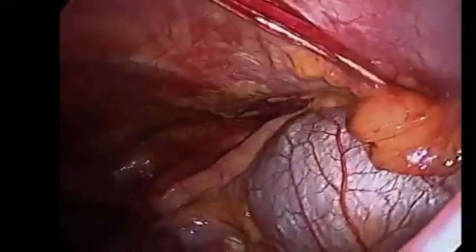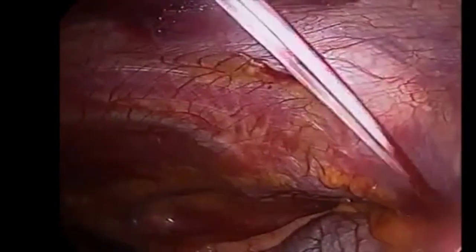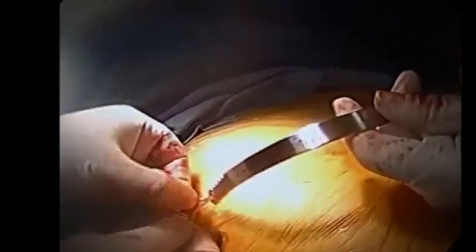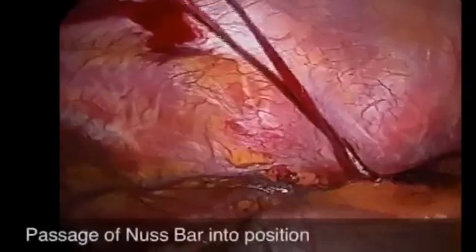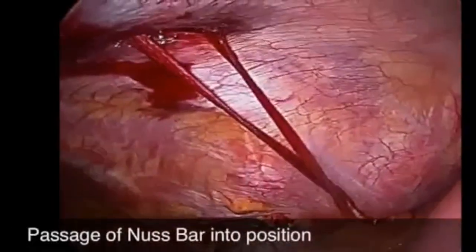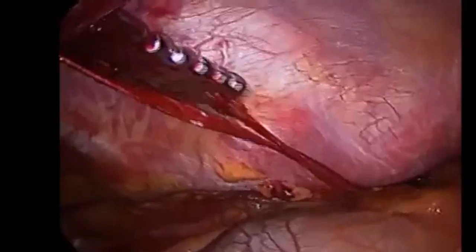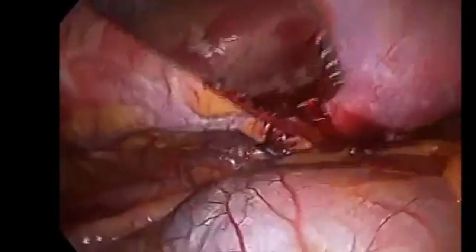Umbilical tapes were applied to the end of the hook and brought out through the right-sided incision. The pre-bent pectus bar was then brought to the field and attached to the umbilical tapes. Using the umbilical tapes as a guide, the pre-bent pectus bar is then replaced into the chest cavity and guided along the same tract as the initial introducer hook, carefully guided anterior to the heart transmediastinally out through the same tract.